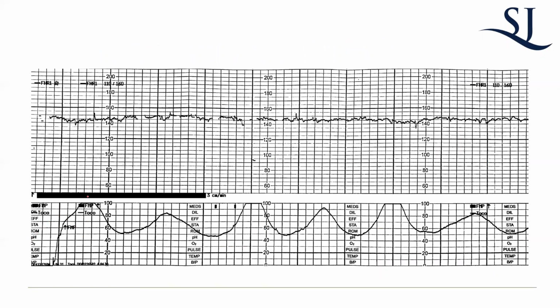This is an example of where you have tachysystole clearly. 1, 2, 3, 4, 5, 6, and it's not even 10 minutes. And baby's fine, right? Baby's fine. That's it. There's nothing you want to worry about too much. So you would just continue present management there. But if this then started to go like this and kind of hang out here, then you would want to do something to relieve this.